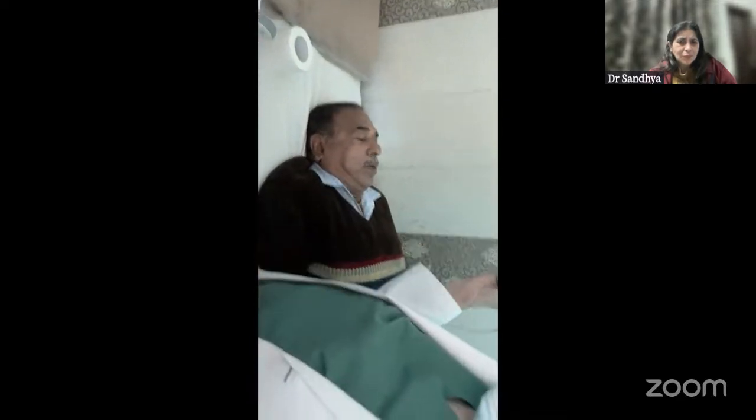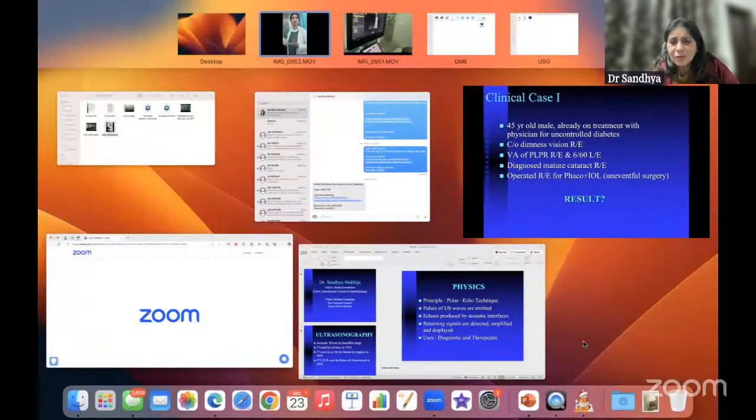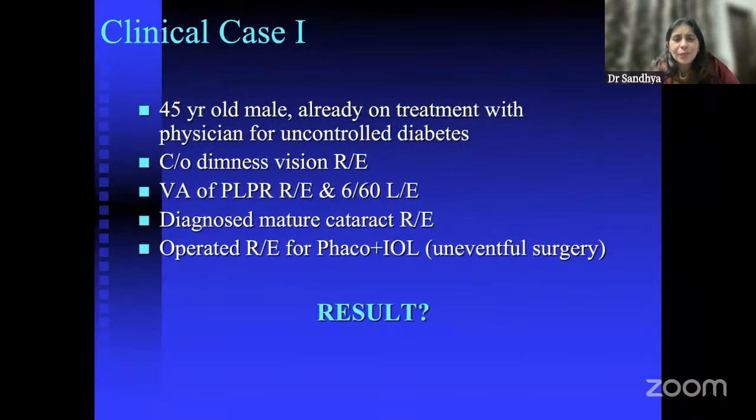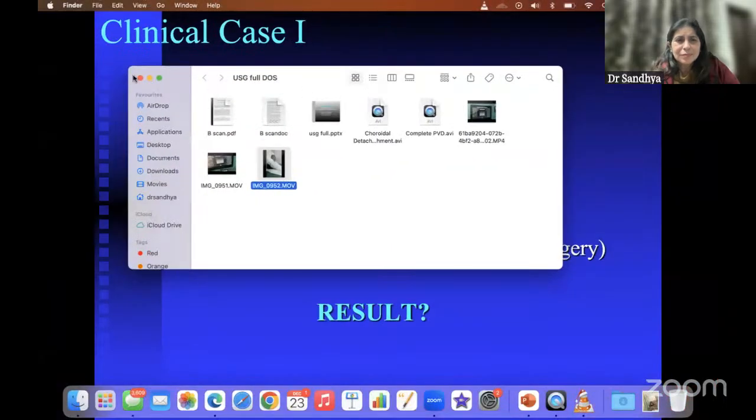This patient is having fresh vitreous hemorrhage in one eye. He's diabetic and hypertensive. In the other eye, there are hardly any changes of diabetic retinopathy, just early hypertensive retinopathy. Now, in this case, we were in a dilemma. Maybe the cause of vitreous hemorrhage is some kind of a tear or probably a neovascularization. So that's what we have to rule out in ultrasound. Do we look for a horseshoe tear or some kind of tear in the retinal periphery, or do we look for some neovascularization or a front? That is what ultrasound gives us, important information regarding the cause of this hemorrhage.